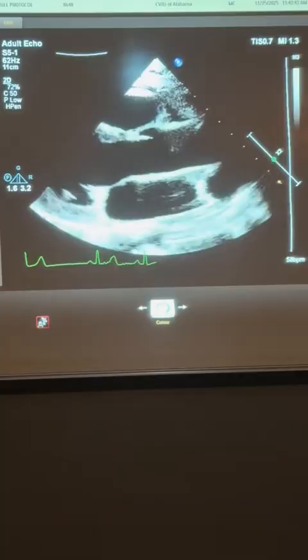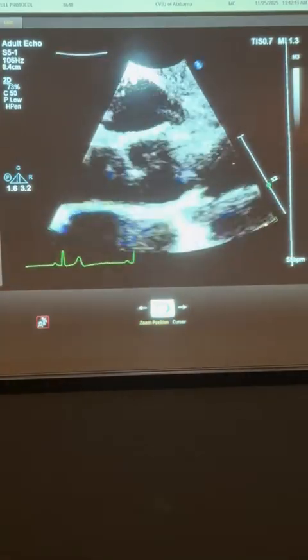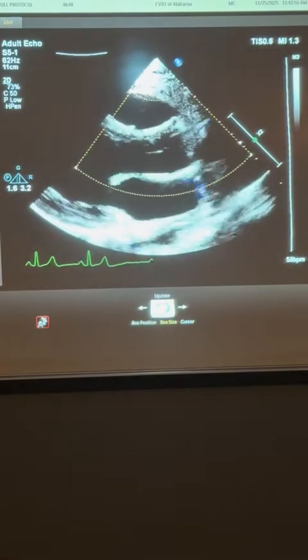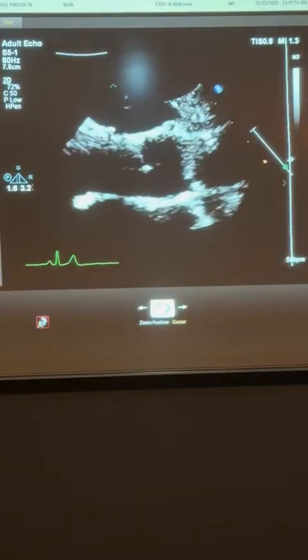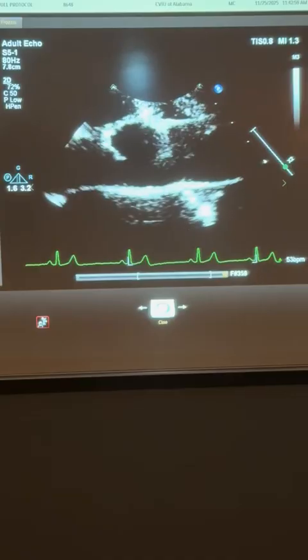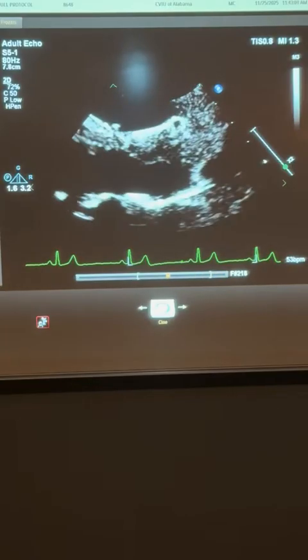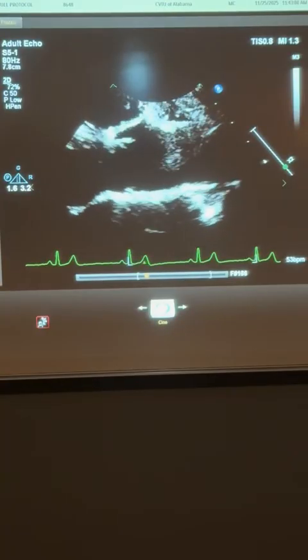Then we're going to zoom our aortic valve. Once we get a few beats, I'm going to freeze it, and I'm going to scroll to where on the cycle? Around the end of the T wave, when the valve is mid to end, when it's wide open, right?